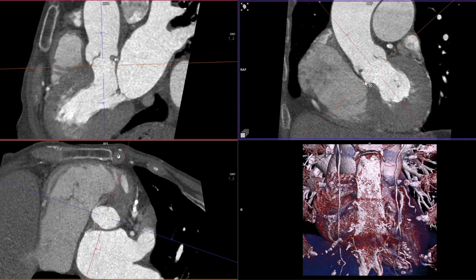Now the membranous septum length can be measured between the orange line representing the aortic annulus plane and the beginning of the muscular septum.